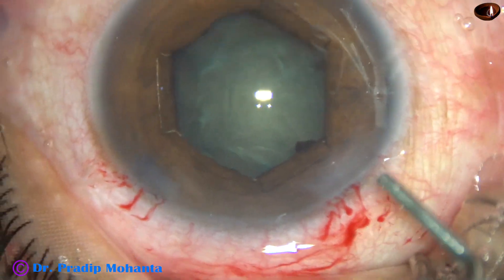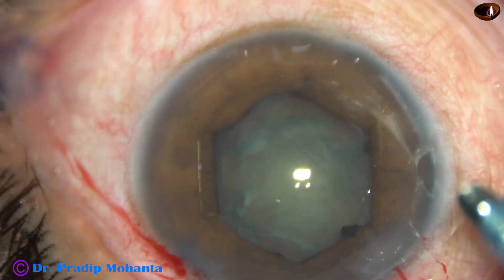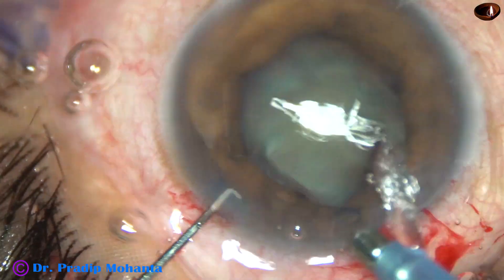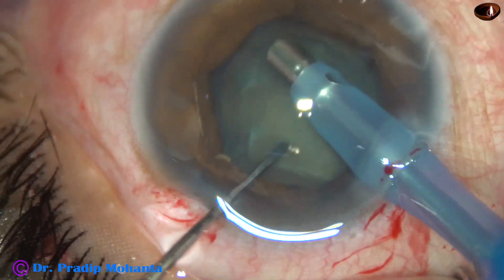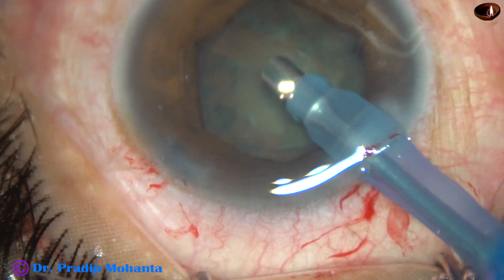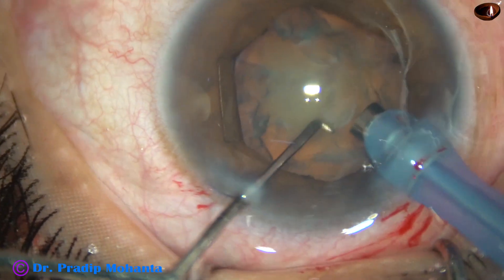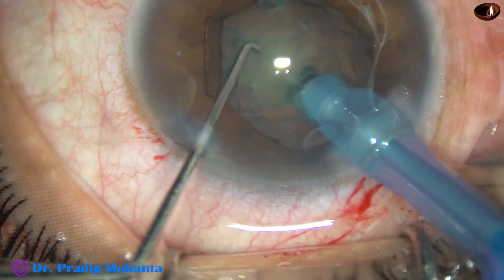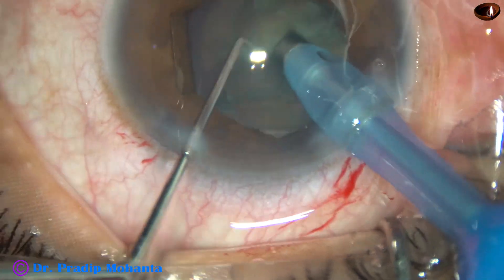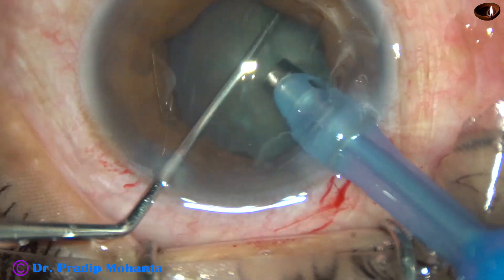Visco is again injected. Now is the time to introduce the phaco handpiece. The tip of the phaco needle goes into the anterior chamber with its bevel down. I am in phaco 2 mode where the vacuum is high, about 450, and I am aspirating some superficial cortical lens matter. The handpiece is turned, bevel is up, and vacuum is reduced to about 400. The tip is buried and the nucleus is held at the center — if we go beyond the central area, we cannot hold it because the nucleus is softer peripherally.